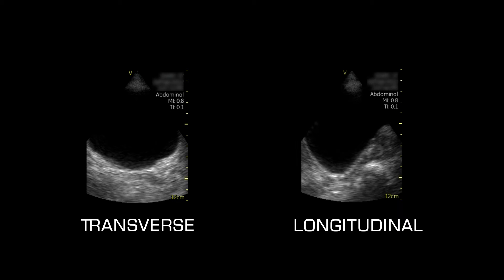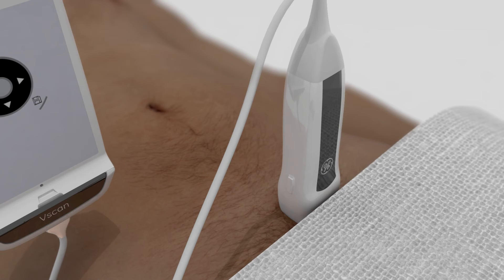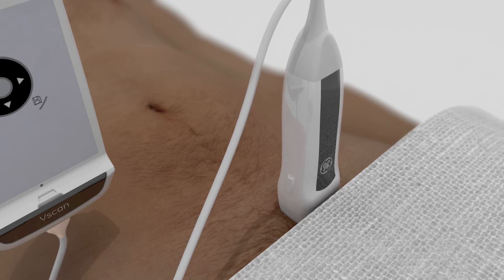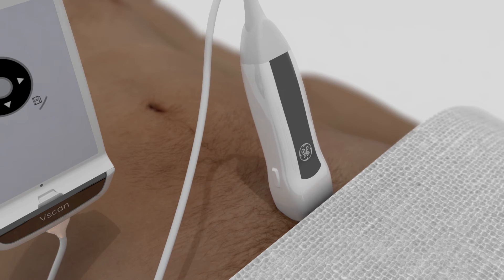The bladder should be scanned in the transverse and longitudinal views. The transverse, antero-posterior, and longitudinal measurements of the bladder can be used to calculate the volume of urine. To obtain a transverse view of the bladder, position the probe so that the probe marker is pointing toward the patient's right. The urinary bladder is a pelvic organ, so the transducer must be positioned just superior to the pubic symphysis and aimed into the pelvic cavity.